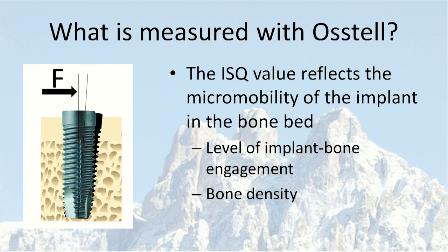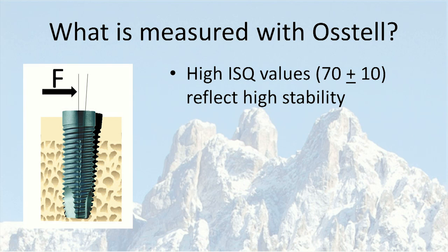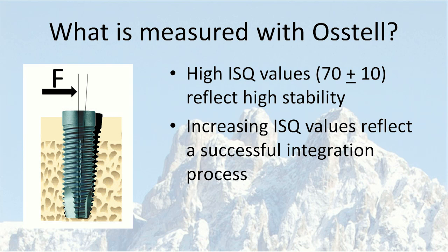And the factors deciding how much the implant is displaced or the ISQ value is the degree of bone density and how well the implant is engaged with that bone density. So it's again all about bone density, surgical technique, and the implant design. We can also conclude that high ISQ values reflect high stability and successful implants. We have seen that increasing ISQ values reflect a successful integration process irrespective of which level we start.